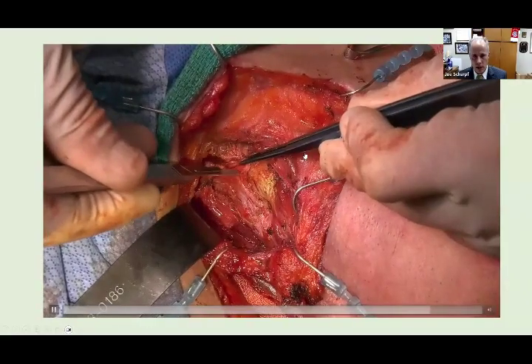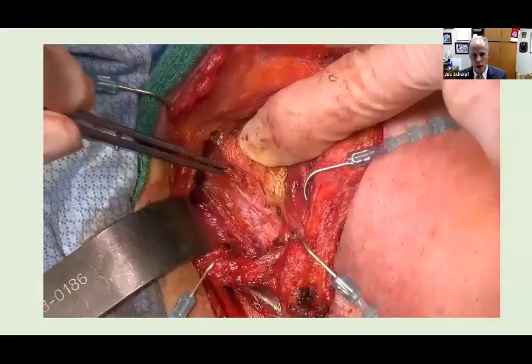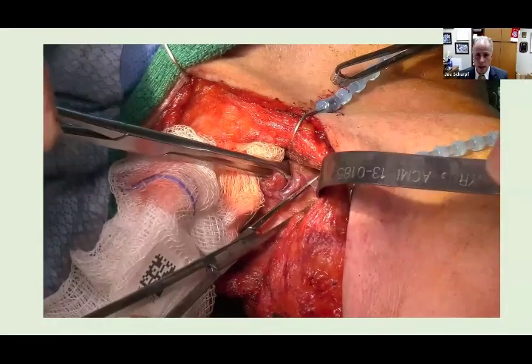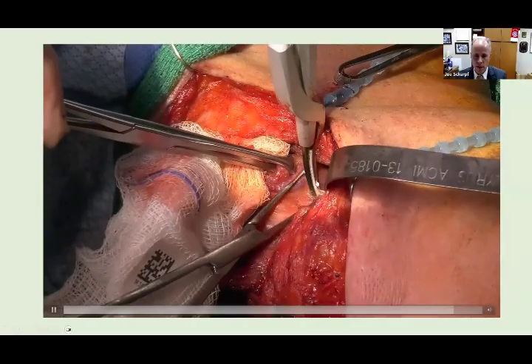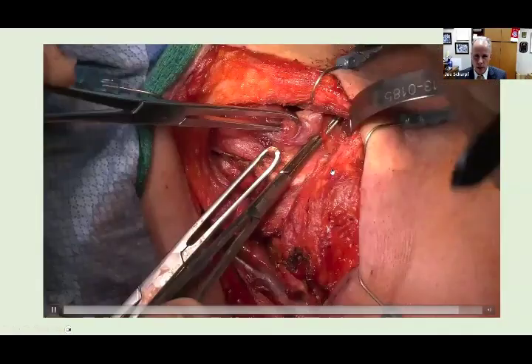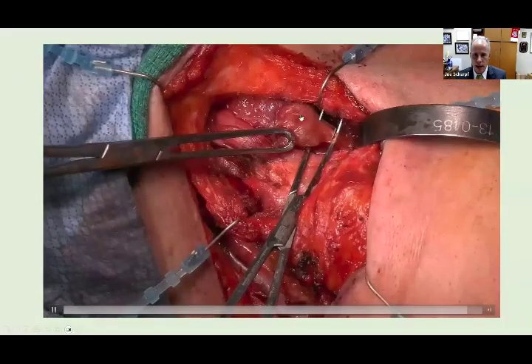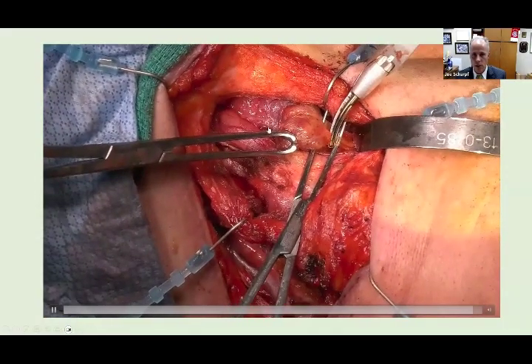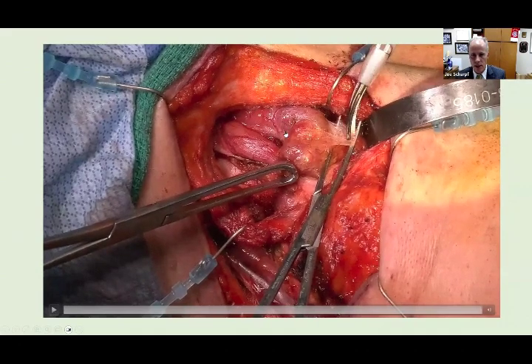I continue on with the rest of the central neck. I went to the other side also to remove it. And on the other side, as I started to take down the superior pole, I found the superior nerve coming up right over there, which stimulated well. But then the gland looks quite normal on the other side, which is quite interesting, how the protocol didn't necessarily affect it quite the same.